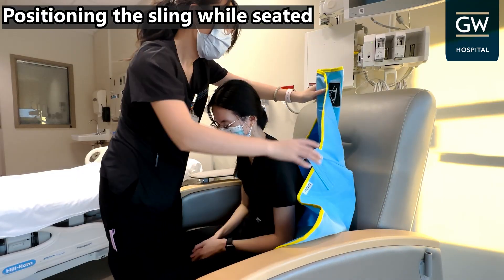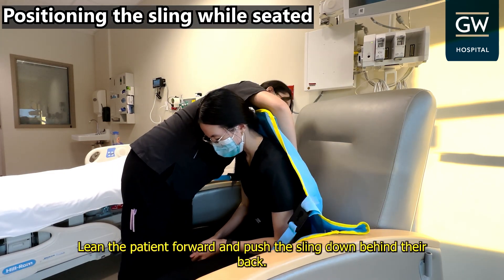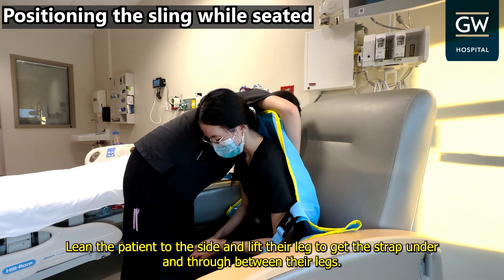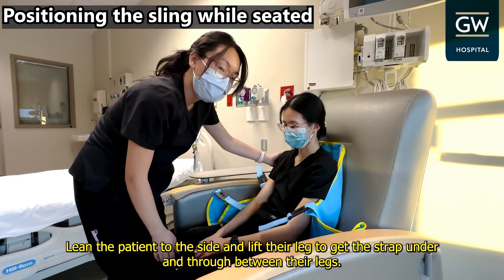Positioning the sling while seated: lean the patient forward and push the sling down behind their back. Lean the patient to the side and lift their leg to get the strap under and through between their legs.